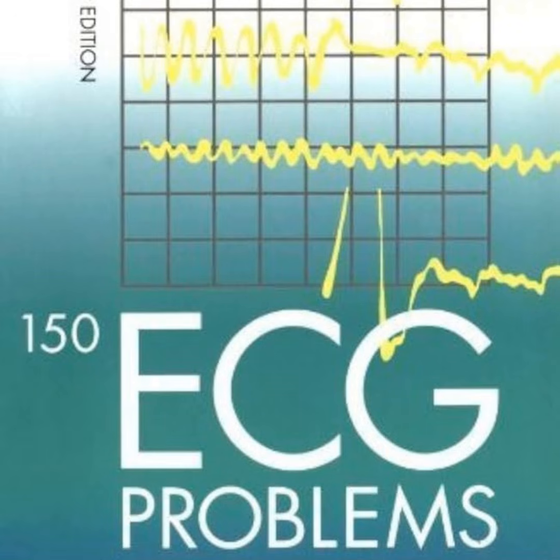But if you synthesize that tracing with the actual physiological state of the patient sitting in front of you, the management pathway changes entirely. Because she's pregnant. Precisely. Pregnancy induces this massive hyperdynamic state. I mean, maternal plasma volume increases by up to 50%. Wow, 50% is huge. It is. And that massively drives up cardiac output. In that specific physiological environment, ventricular extrasystoles are incredibly common. And more importantly, they're usually entirely benign.